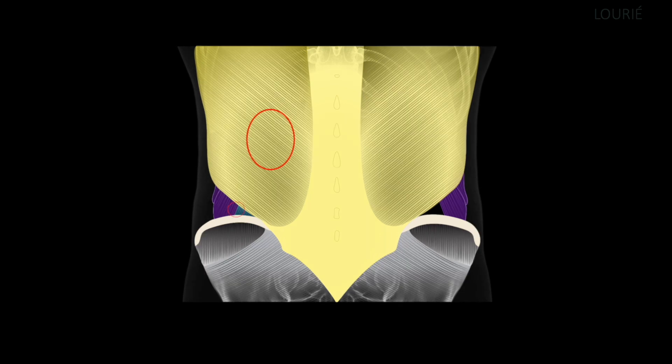Here you can see Petit's hernia, and on the patient's left side, you see the floor of Petit's hernia is the blue internal oblique.